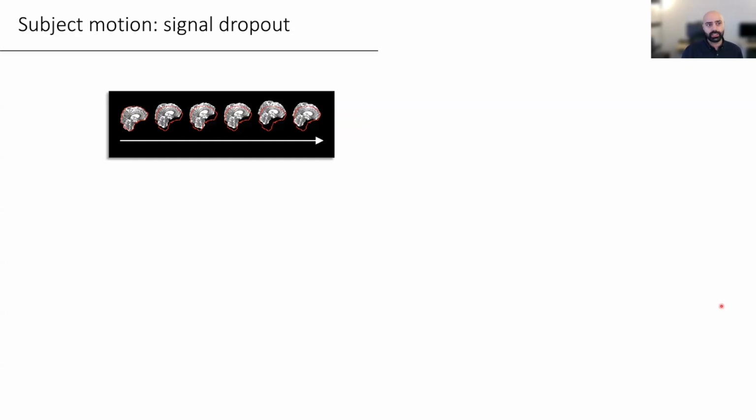and we'll start with the main thing that everyone should care about and correct for, and that's motion processing, because it deals with things that are very clear in diffusion, artifacts that are very clear. So it's not a question of if your subject moves, it's a question of when your subject moves. Data is usually acquired over several minutes. In the past, it was a lot longer, usually 10, 15, 20-minute acquisitions. Now acquisitions are shorter, typically under 10 minutes, but the average study will acquire diffusion data for anywhere between 5 to 10 minutes.